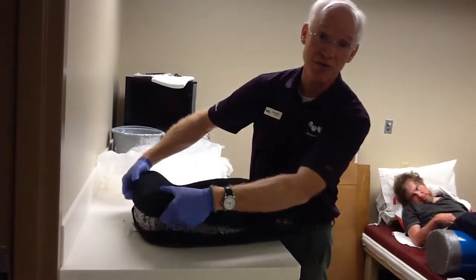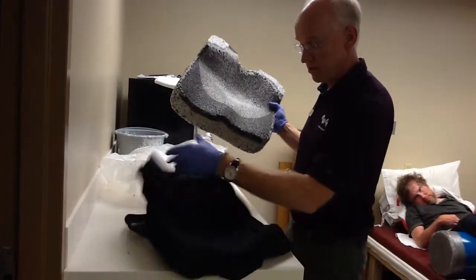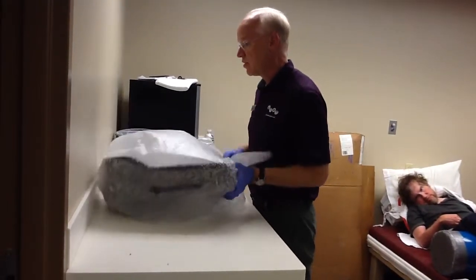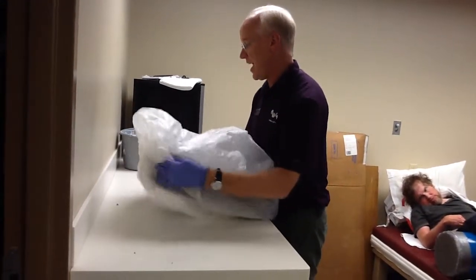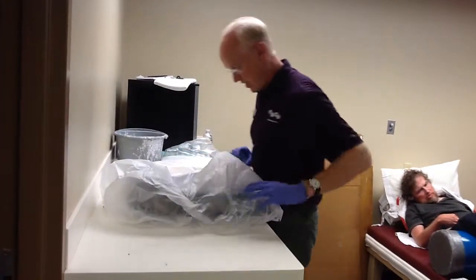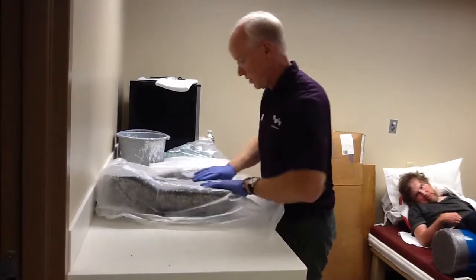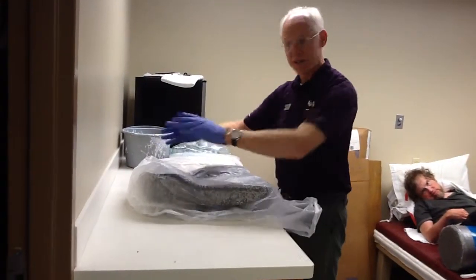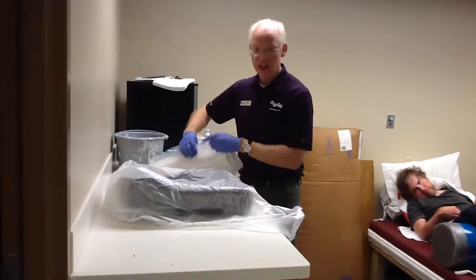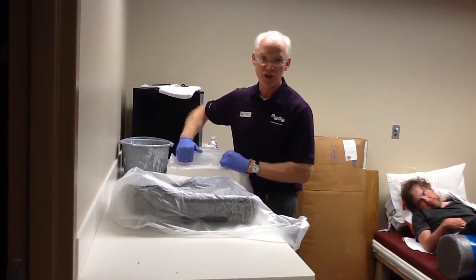I've made sure that the cushion sufficiently fits the client as far as offloading and loading — that's been verified. I'm simply going to remove the cushion from its cover, set that to the side, put it inside a loose plastic bag, and try to get the seam of the bag in a logical position. What we're going to do now is lay plaster on the top and the sides down to capture about one inch of the platform, so that we don't only have the top contour. Casting down to the table gives us the orientation of the cushion — we can't replicate the cushion without good orientation.